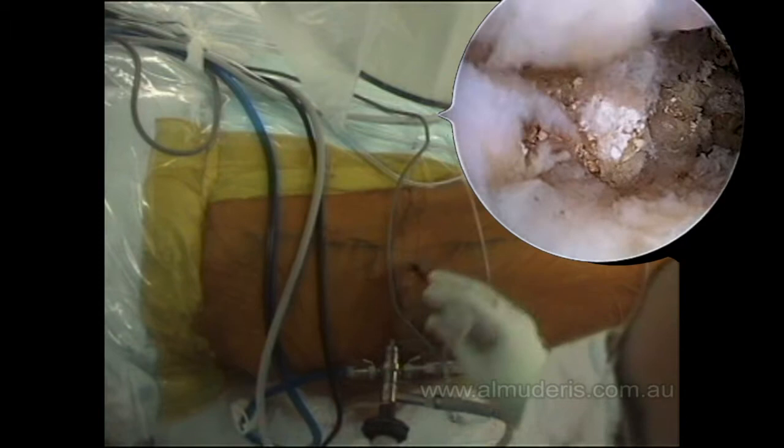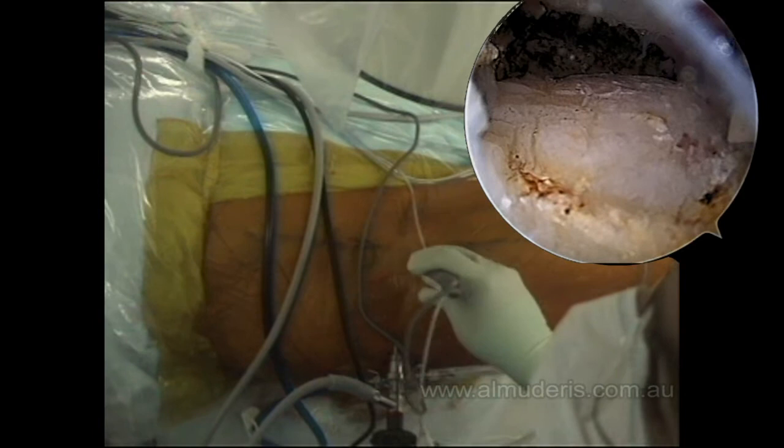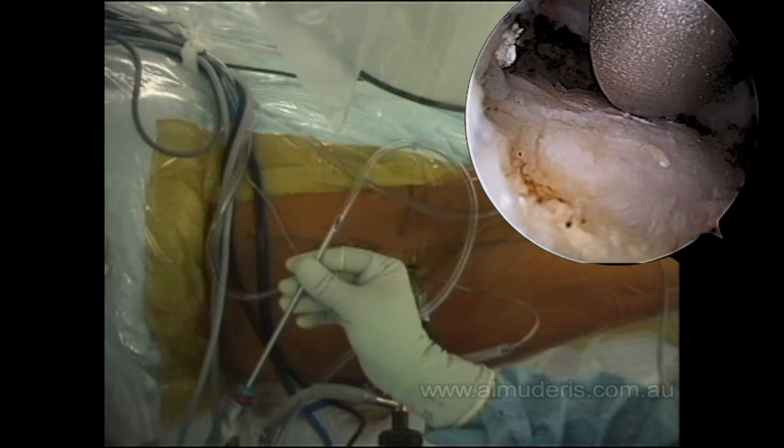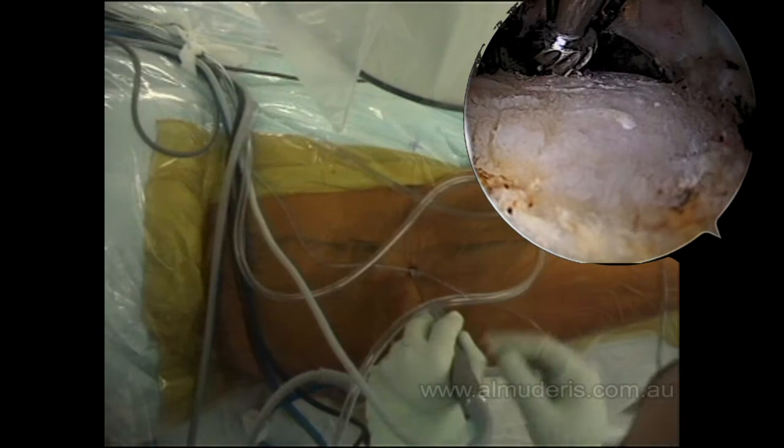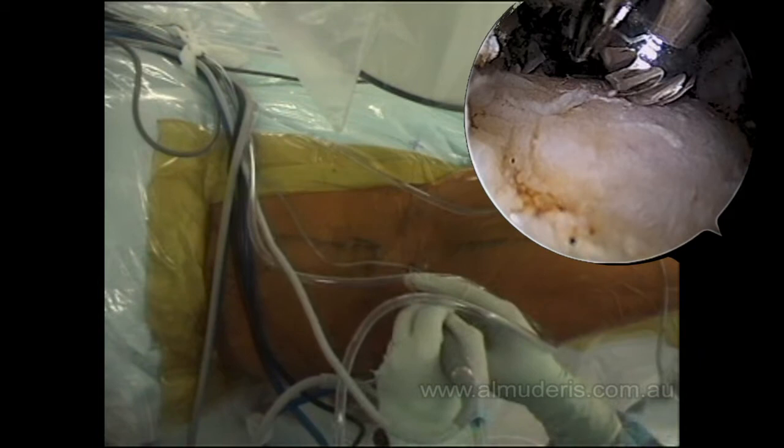This is synovitis — this is the area that we need to clear where the main bump is. It is the head-neck junction. You can see this elevation — that is a fair-sized femoral bump. I use a small burr to treat the femoral bump. I identify the location of the area to clear — you can see there is a hump extending from the anterior inferior to the anterior superior. We need to be very careful with burring the bump.